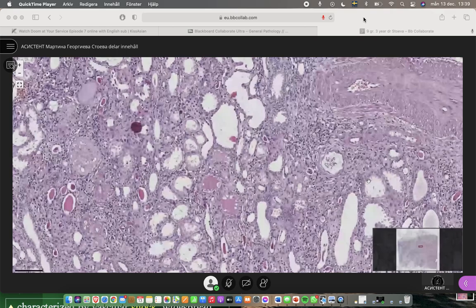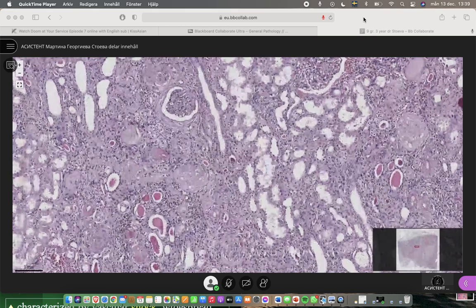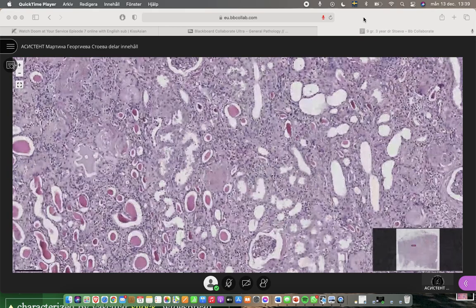In benign hypertension, only the afferent arteriole is hyalinized, like in our case. I'm searching for an area where, yeah, here. You can see that there is one glomerulus with arterioles. Here is the one and another one here, but only one of them is hyalinized. This is due to the fact that here the cause is benign hypertension.